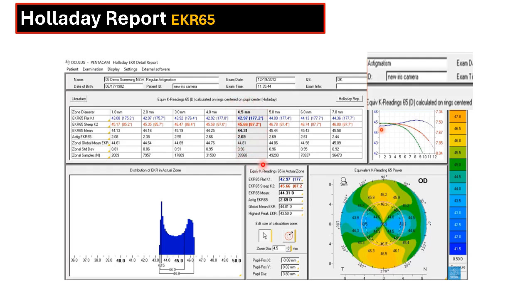Now, the previous K reading that is taken by all manual keratometers and all the old keratometers is based on the anterior surface of the cornea, measuring only the K reading of the anterior surface, and also taken over a central corneal zone of 3.2 millimeters. That's why for all the previous IOL calculation formulas, you need an A constant that compensates for the back surface of the cornea.